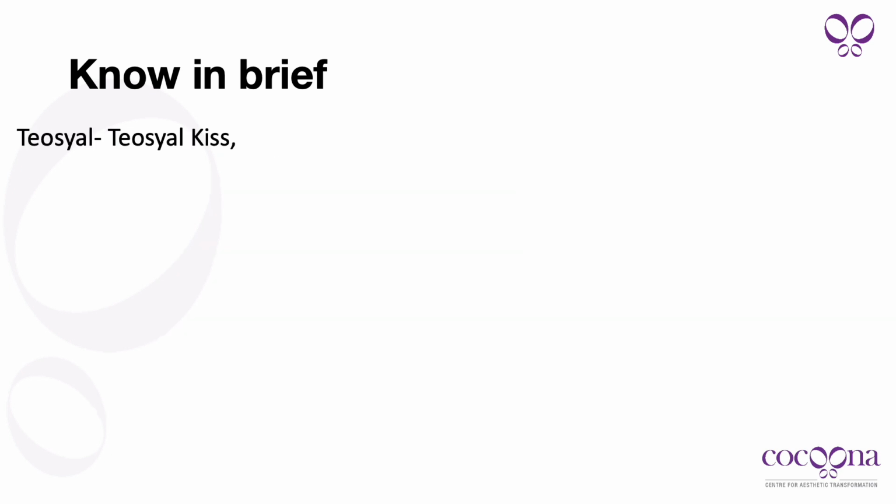Teosyal, I've used it for many years. I like using Teosyal. It does have a predictable long-term benefit. Of course, it does have its own disadvantages as well. Teosyal Kiss is good for lip volume, for lip contour, to rehydrate the lips. Slight risk of lumpiness is there because it retains water.